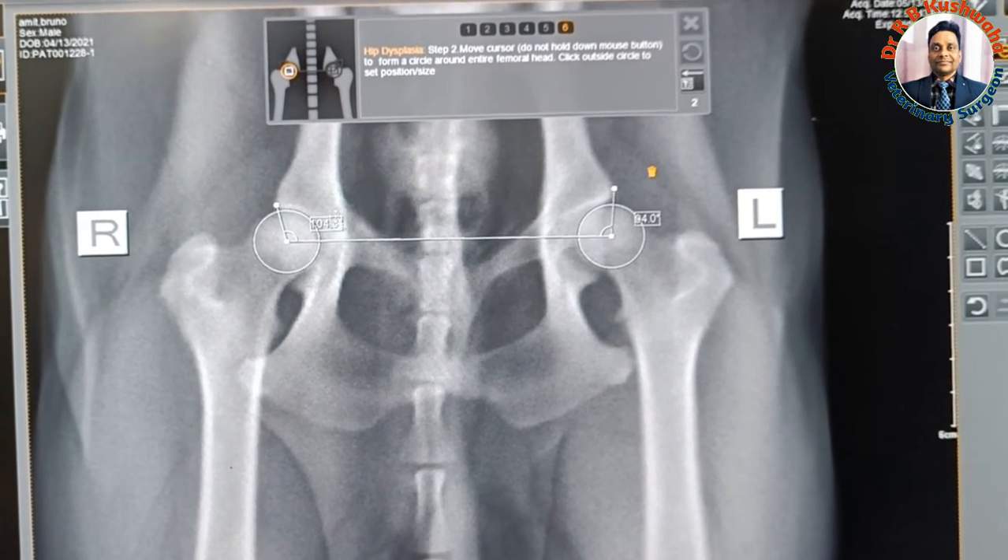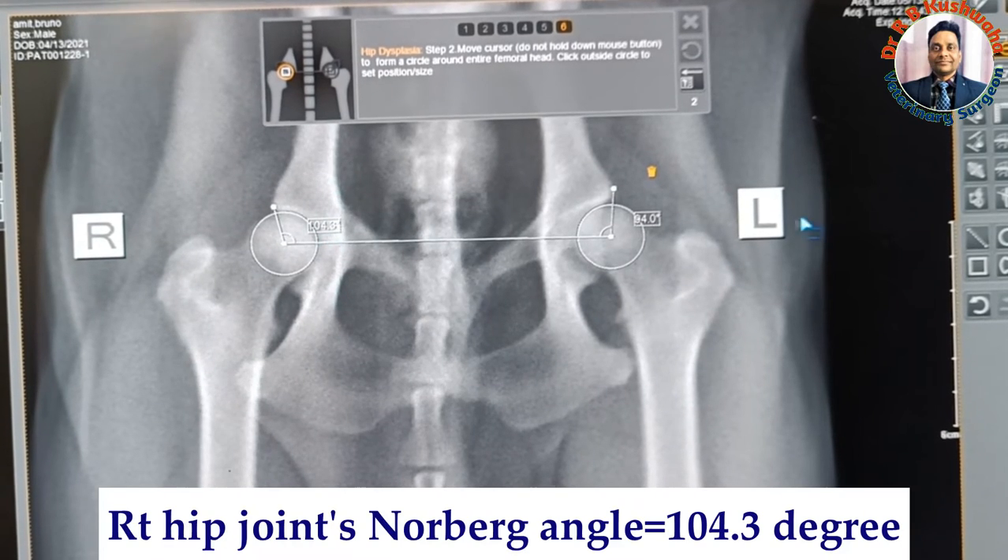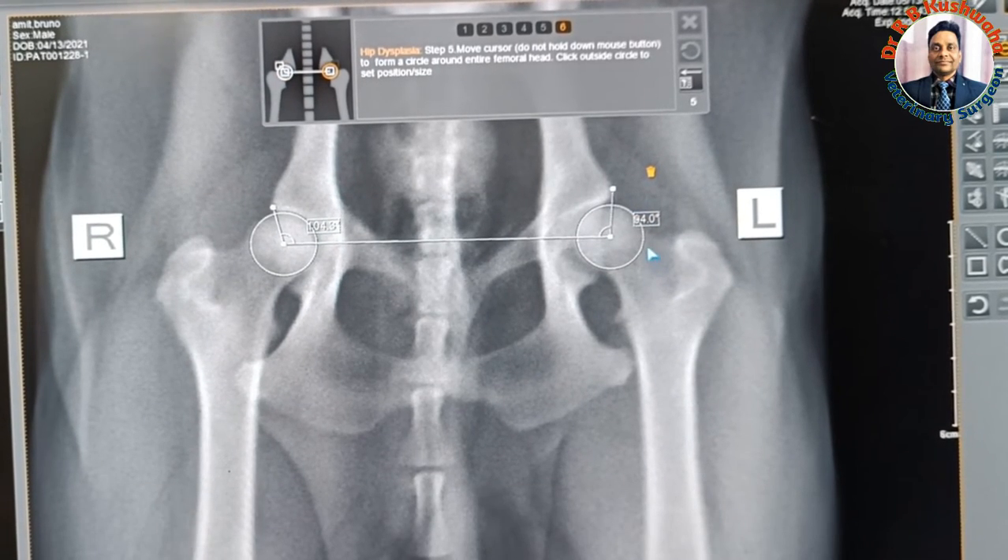The Norberg's angle for the right side of the hip joint is 104.3 degrees, whereas for the left side it is 94 degrees.